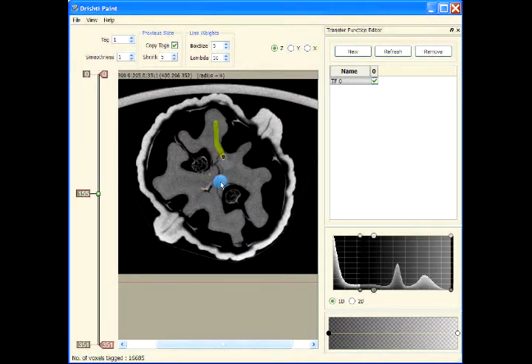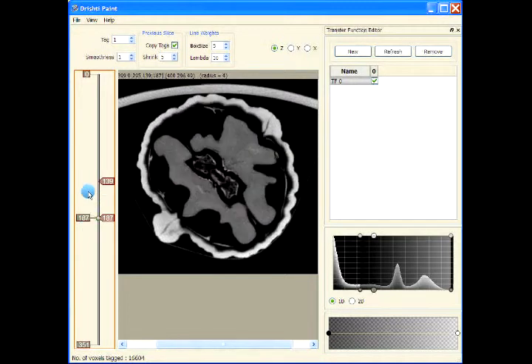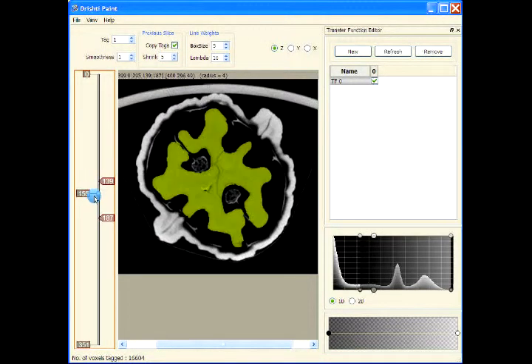So again, tag here, press T, and now press escape to remove this painted information. Now I can restrict my tagging to a certain region. So this is the region in which I want to set my tags. This is my currently tagged region. This is the current slice which I have tagged.